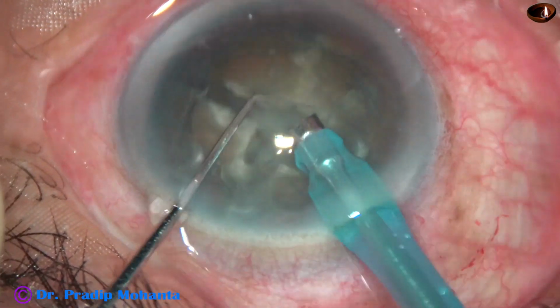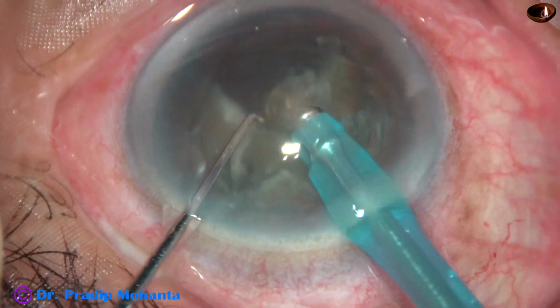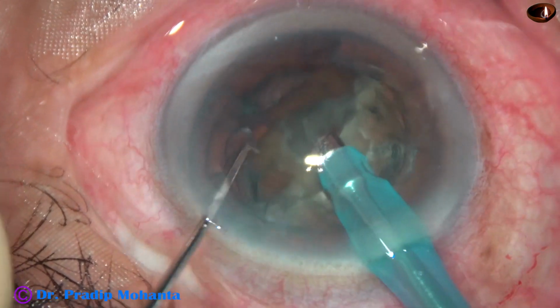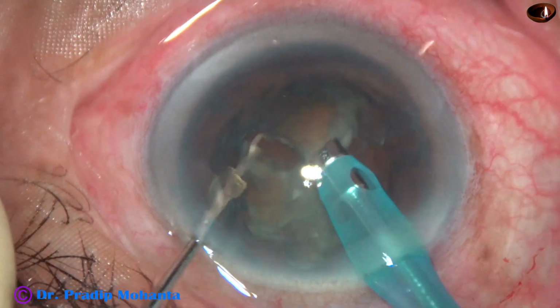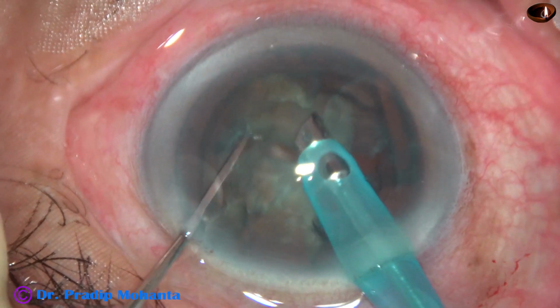And now emulsify the fragments using ultrasonic energy. Phaco power used in these two cases was 60%, flow rate is 45 ml per minute, and vacuum is 450 millimeters of mercury. This is the Oertli Catarhex 3 phaco machine.